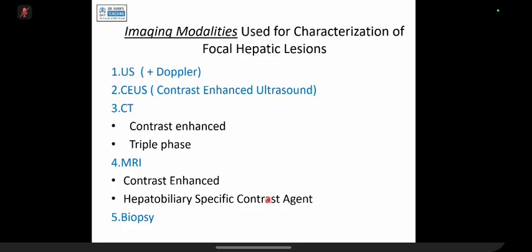Similarly, you can utilize the same principle. Will metastasis have normal hepatocytes? No. HCC, will it have? No. So now it is creeping into even the guidelines. In the classical HCC guidelines, it is now regarded as ancillary. They have not put it in the guidelines for the simple reason that every facility hasn't got this. So they don't want to put it as a guideline.